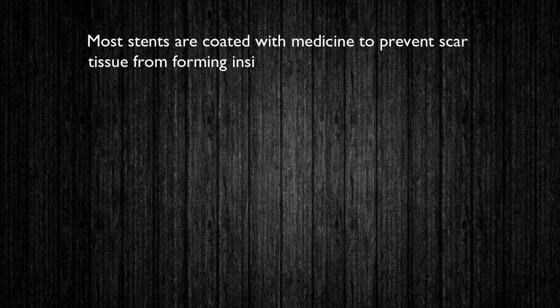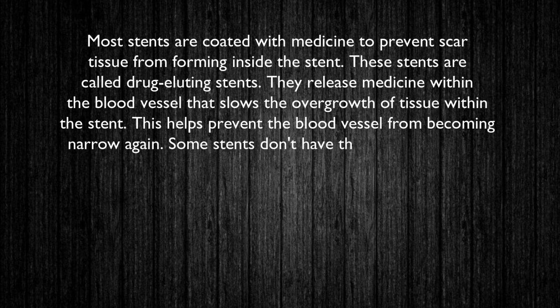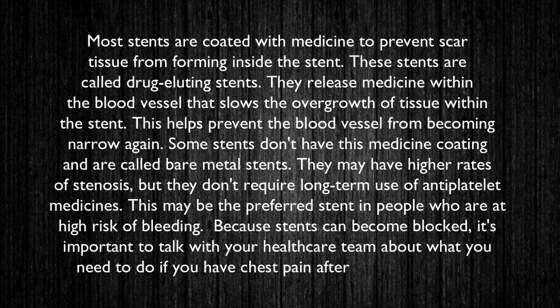Most stents are coated with medicine to prevent scar tissue from forming inside the stent. These stents are called drug-eluting stents. They release medicine within the blood vessel that slows the overgrowth of tissue within the stent. This helps prevent the blood vessel from becoming narrow again.